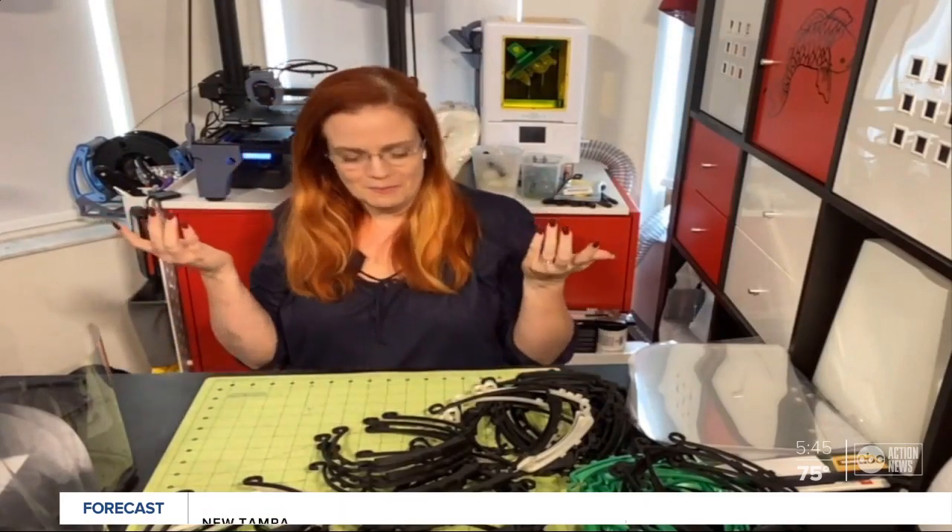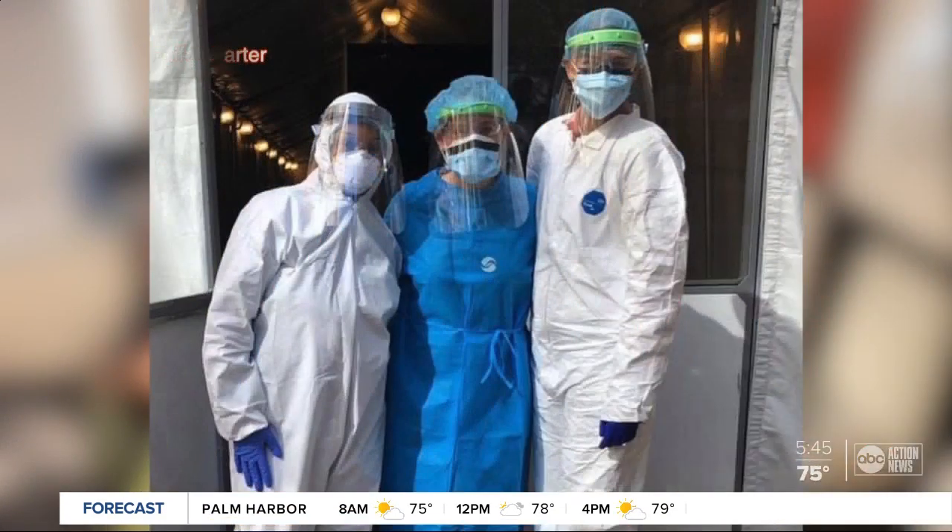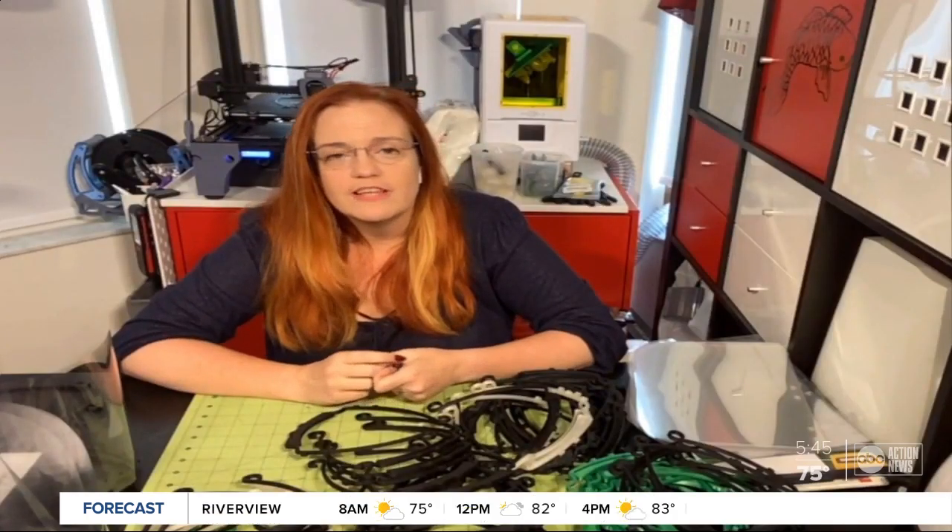Carter is in charge of the makers in the Tampa Bay Area. So far they've created 3,500 shields for local hospitals, and they're working on about 1,500 more this week. It's wonderful that so many people are willing to volunteer their time, because almost all of us are doing this out of pocket.